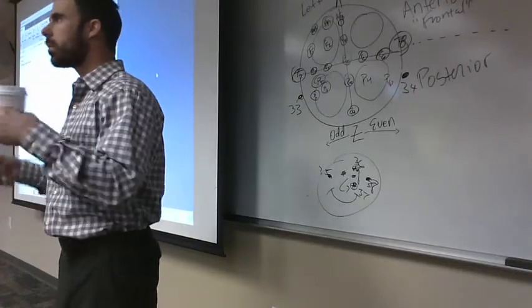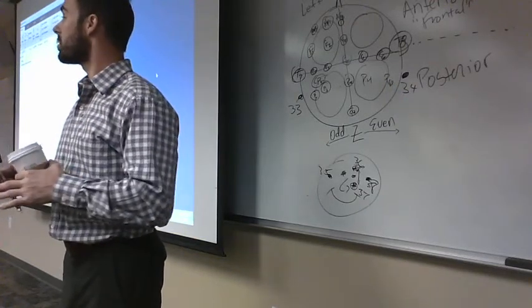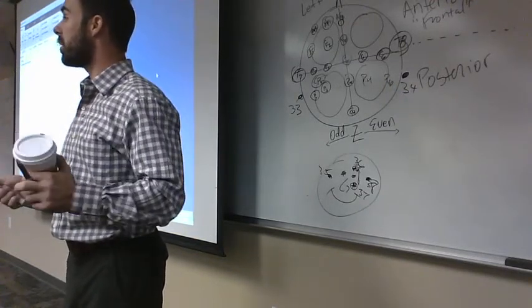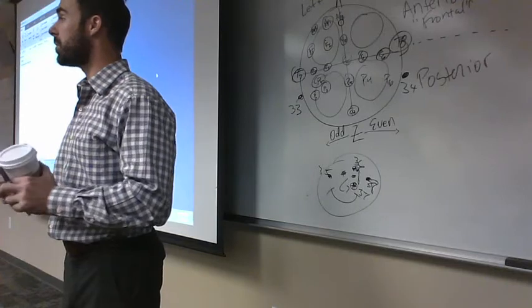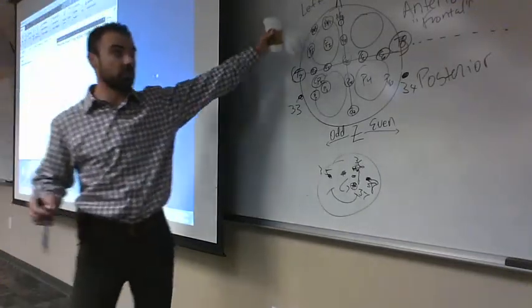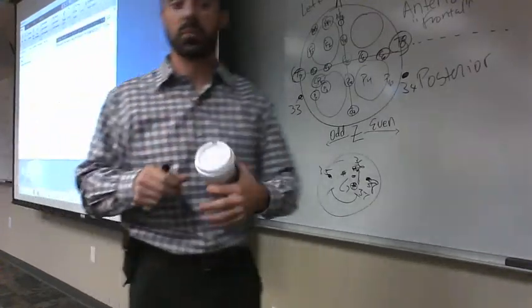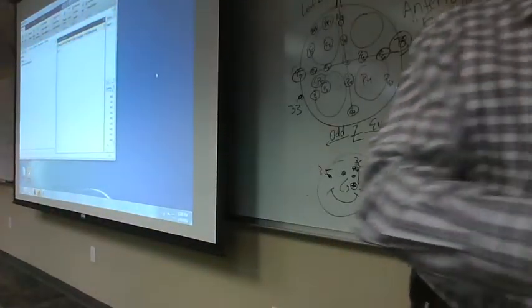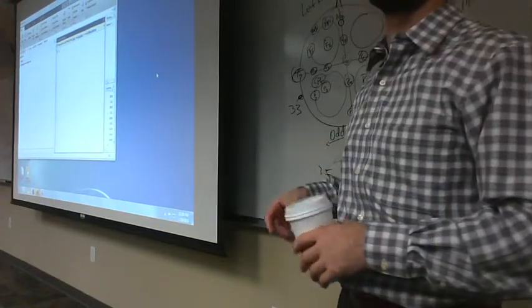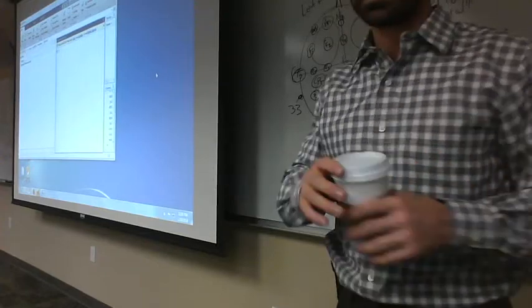Just make sure it's useful to write down the steps that we're doing, write down some of the notes of the key points that we've made about why it's useful to code instead of work in manual processes, and some of the structures we talked about with the 10-20 system, the organization, the coordinate system. All this kind of stuff is really, really useful to know, because I'm just going to refer to electrode P3 in the future, and I'm just going to assume that you know that that means left parietal, stuff like that.